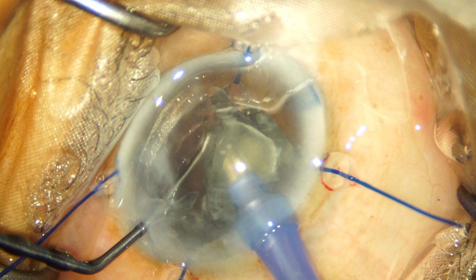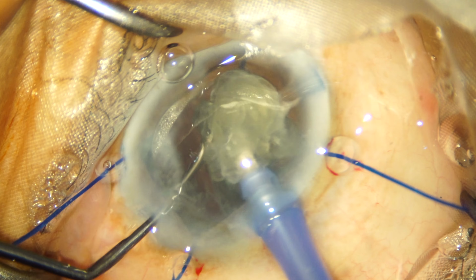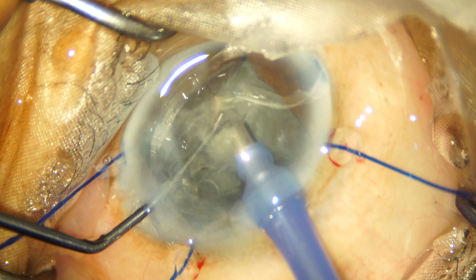Secondly, this patient had a non-dilating pupil, as is very often seen in pseudoexfoliation cases. Also, the nucleus was a grade 4 plus cataract. And as you can see, I had to make four extra incisions when I was inserting the iris hooks.